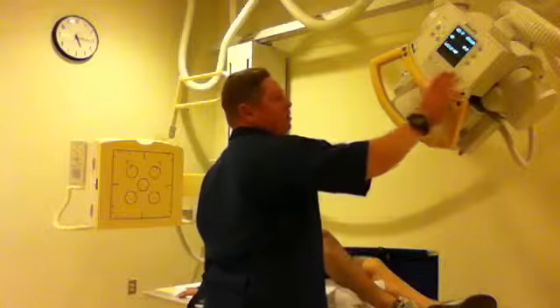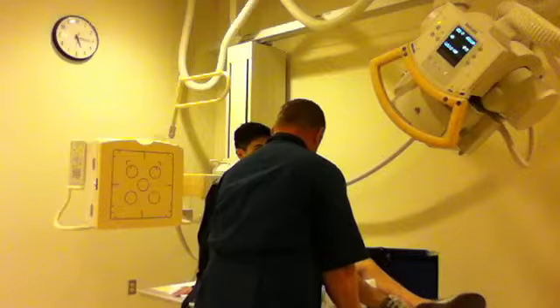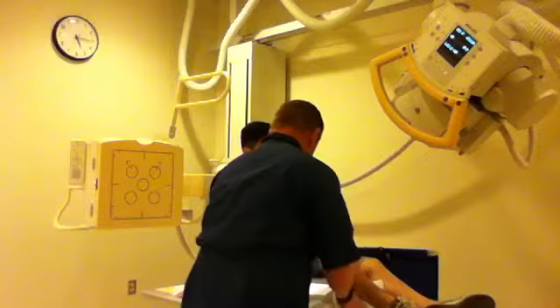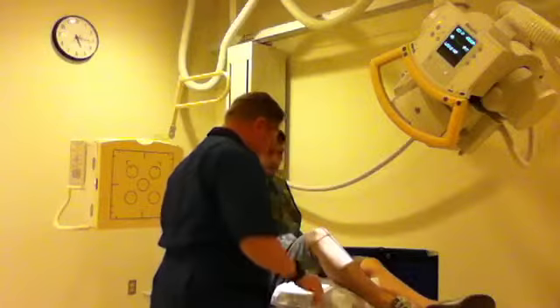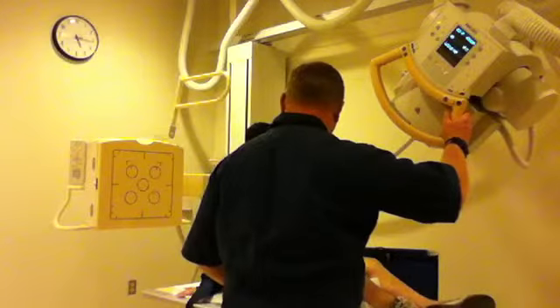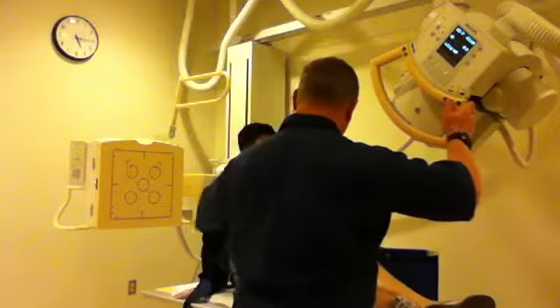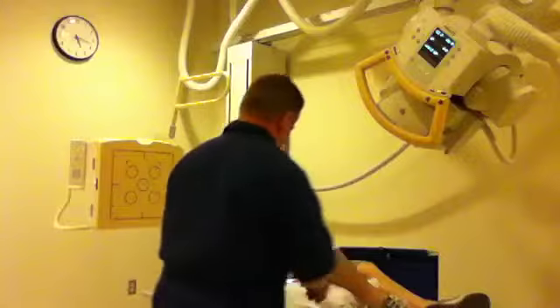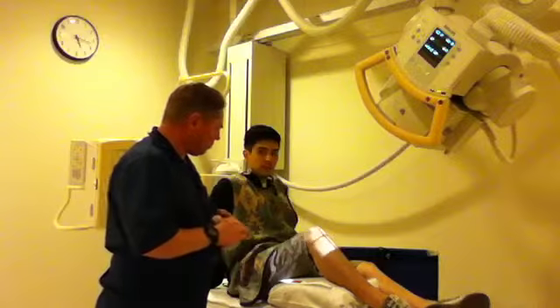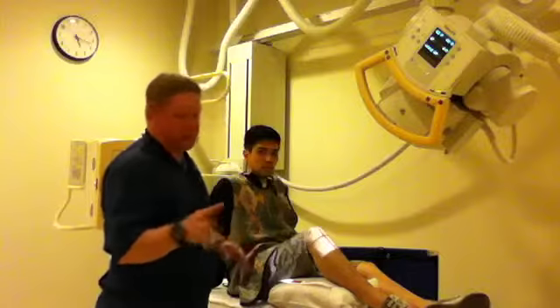Alright, now that's said, I'm going to do this at 60 at 4, roughly, depending on the size of the patient.